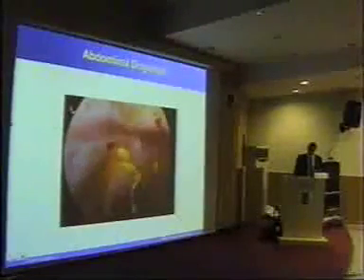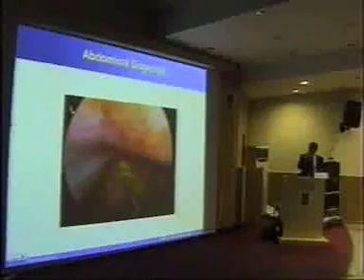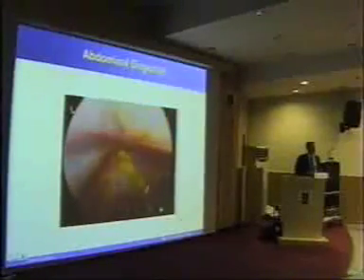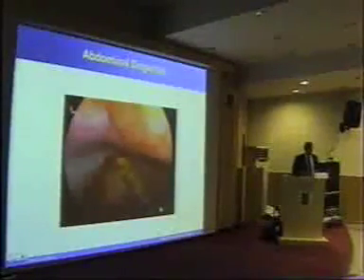Now, another area, so that's nephrectomy, and we'll talk a bit more about nephrectomy with slightly longer videos, is abdominal diagnosis. And that was a patient who had a Wilms tumour. I'll play that again for you. And had intraperitoneal rupture.